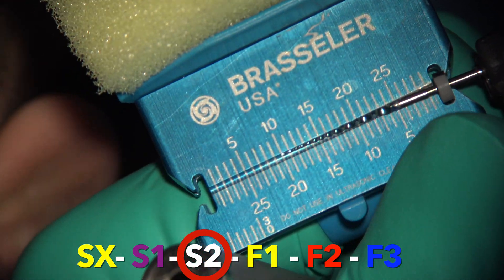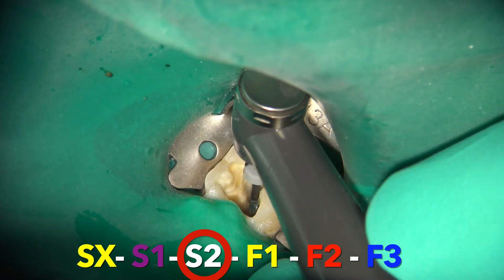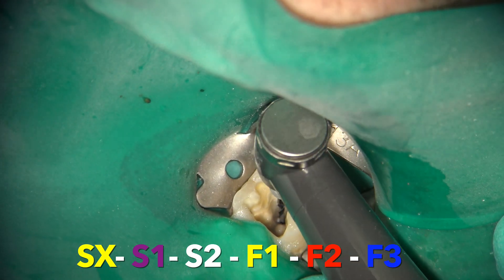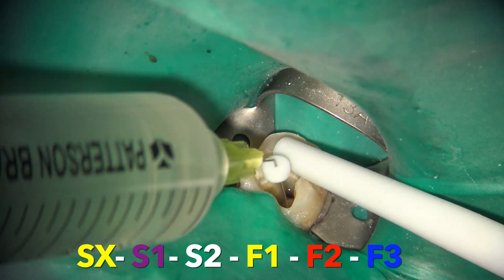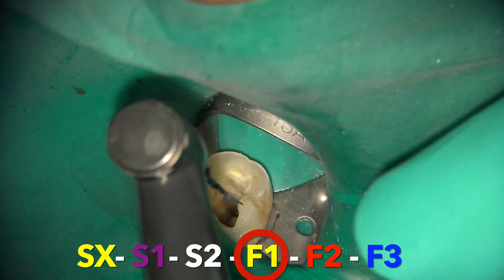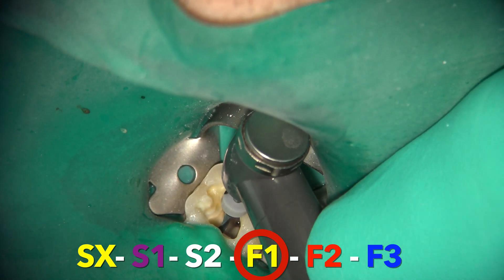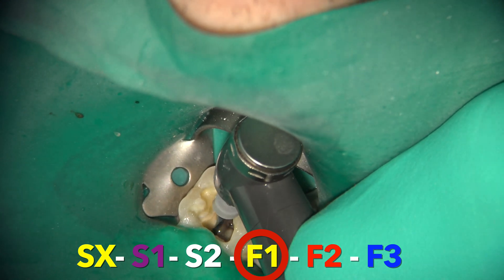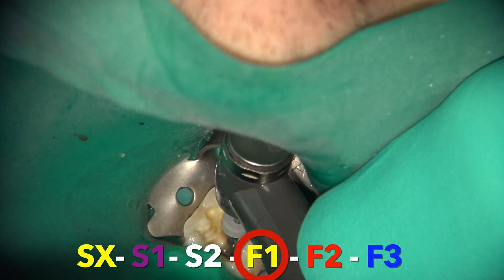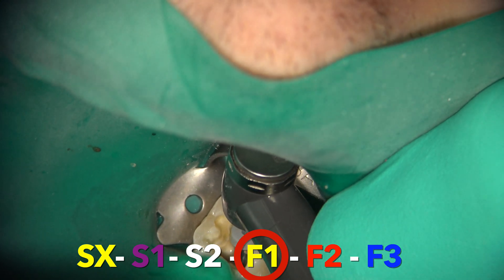I'm paying very close attention to my stoppers, and also using the EndoSync AI as an additional confirmation that I'm at the apex — though it's usually better to just have the AI off and instrument to your stopper and working length. Irrigate and move on to the S2. These files have progressive tapers that are different: the first couple of files scout the apex while enlarging the coronal and mid portions of the tooth, allowing the next set of finishing files to go further in. I take the files out after three strokes using a rhythm motion, then use the EndoSwipe to remove debris from the files and clean out the chip space — a critical component of all instrumentation.